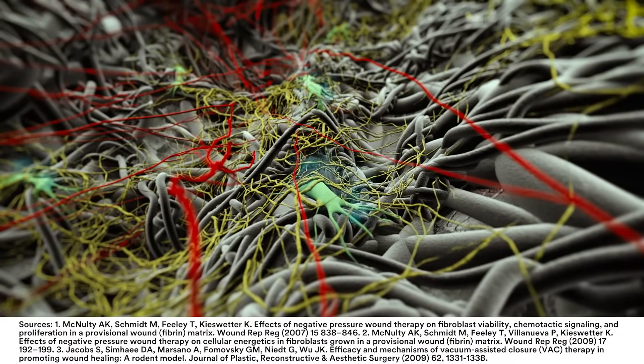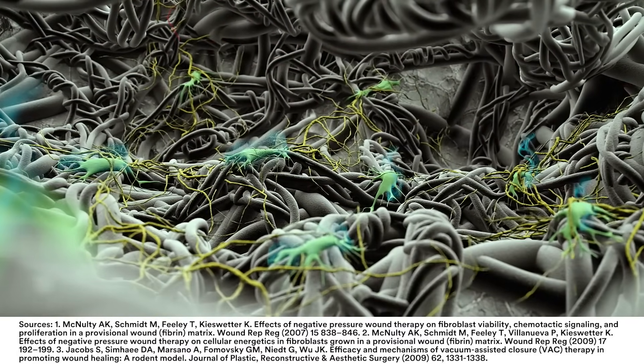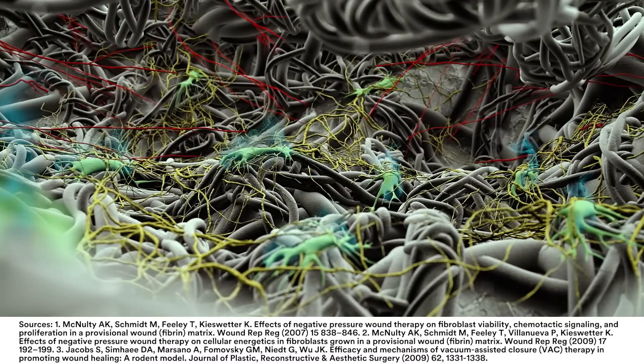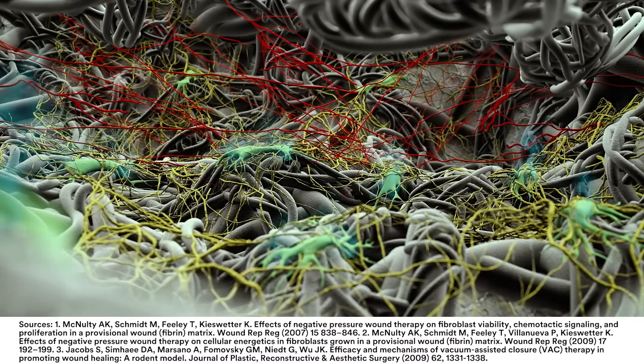In vitro and in vivo studies conducted using negative pressure have shown that these activities include increased metabolic activity, fibroblast migration, cellular proliferation, and extracellular matrix production.